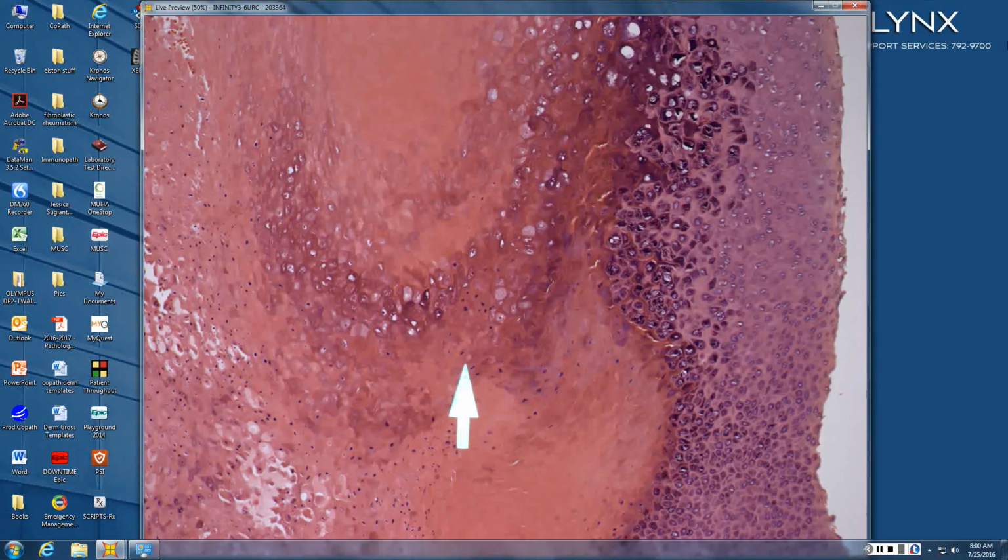I don't see a lot of inflammation, but there's a lot of keratin debris. Does it have retained nuclei? Yeah. Are the retained nuclei flat or round? They are round. What else do you know of that has coarse hypergranulosis and round parakeratosis?